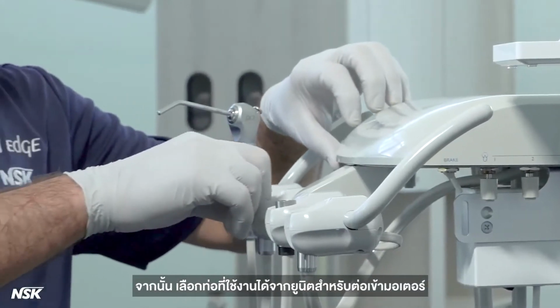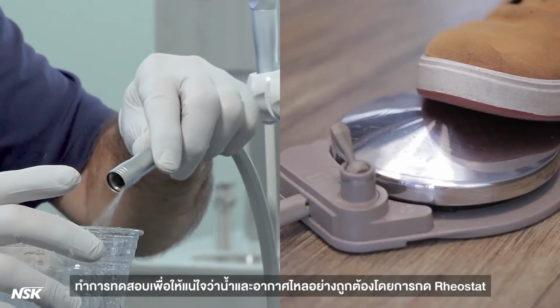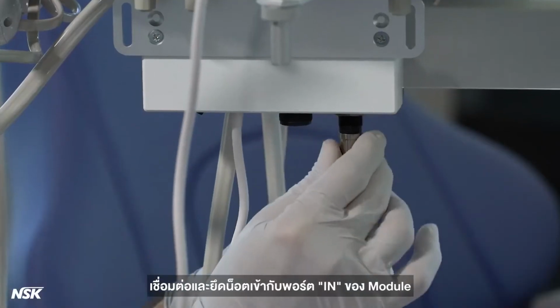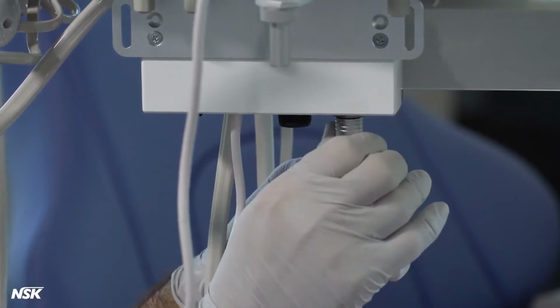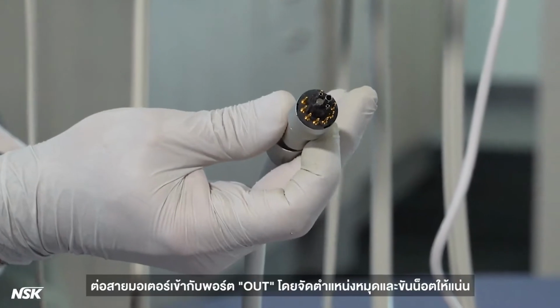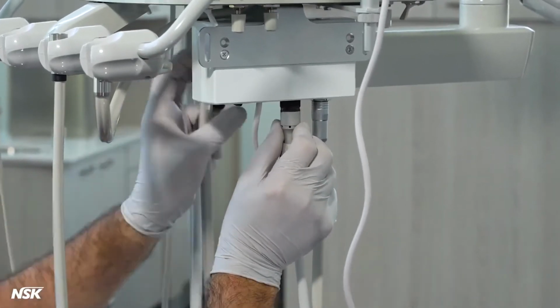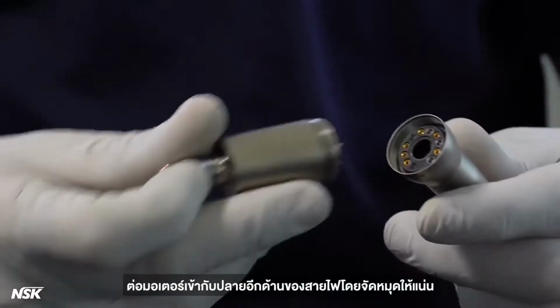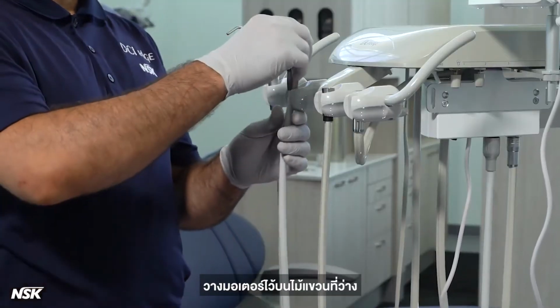Next, pick a functional tubing from the unit as the input for the motor. Run a quick test to make sure water and air are flowing properly by pressing the rheostat. Connect and secure the nut into the in port of the module. Connect the motor cord into the out port by aligning the pins and tighten the nut. Be sure to tighten the nut completely. Connect the motor to the other end of the cord by carefully lining up the pins. Place the motor on the vacant hanger.